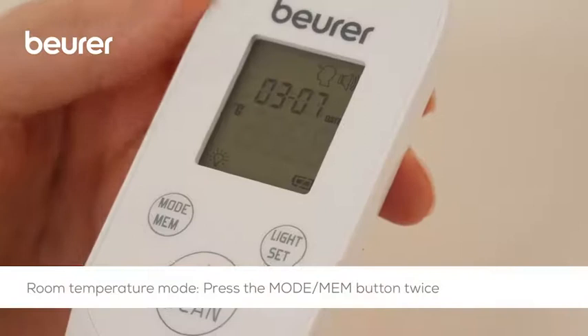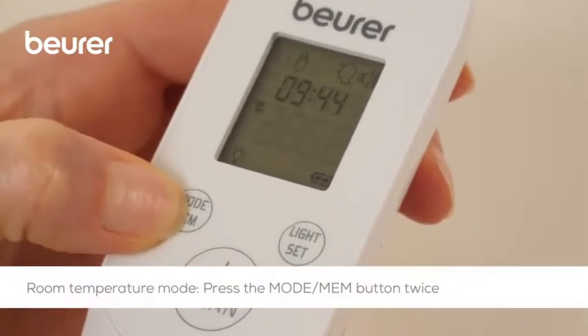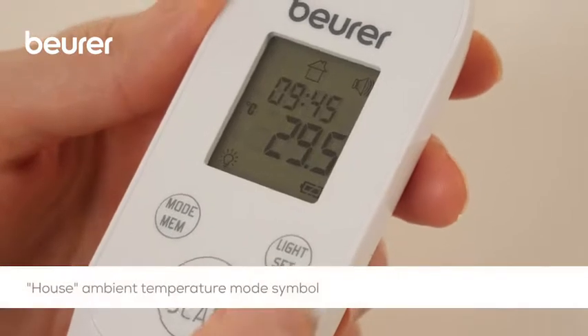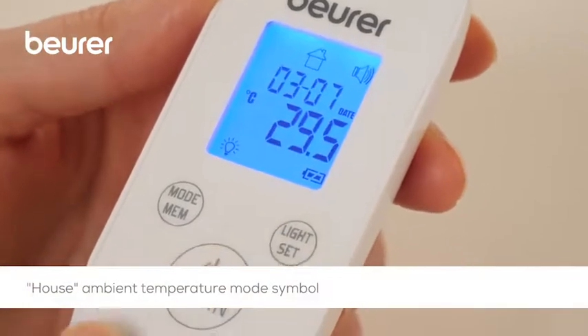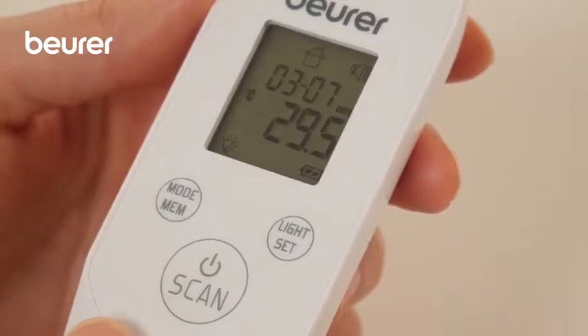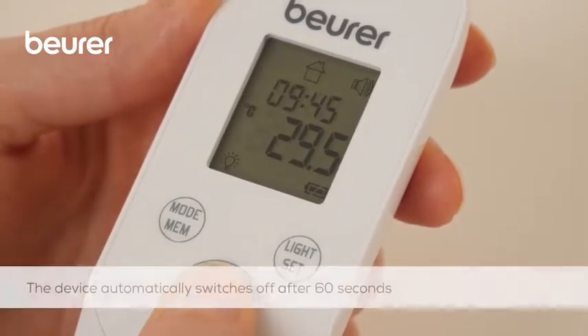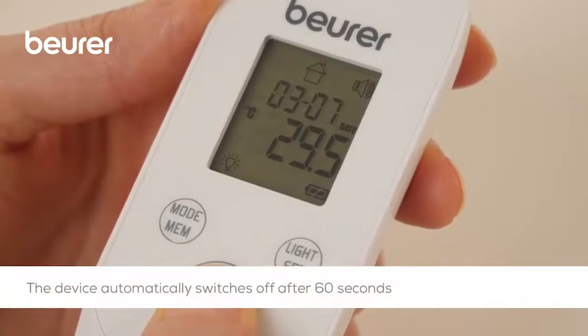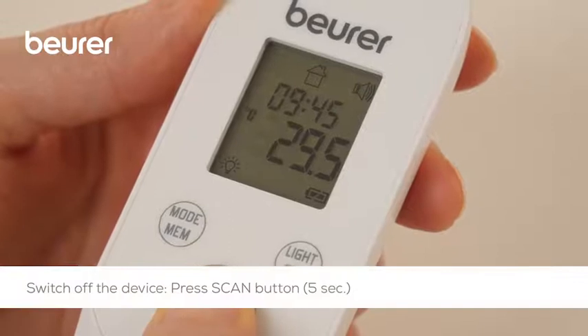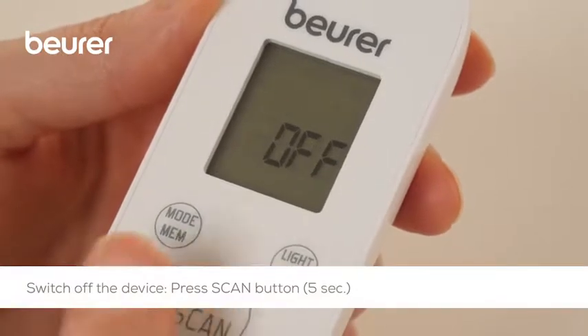To measure the room temperature, briefly press the mode MEM button twice while the thermometer is on. The house symbol and the room temperature are immediately displayed. The device automatically switches off after approximately 60 seconds, or you can press the scan button for 5 seconds to switch it off.